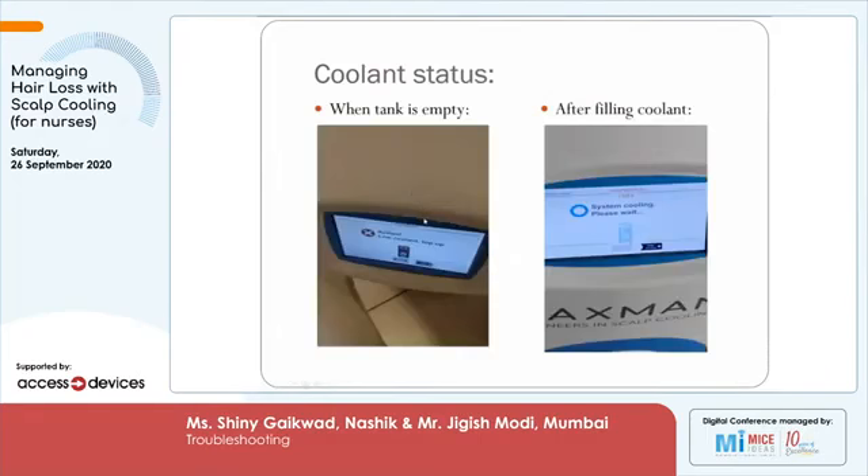Whenever the coolant is low, the machine will give you an alarm on the left side saying 'low coolant.' But it will allow the cooling to happen, so you can complete your chemotherapy cycles and then call the engineer. If nurses are trying to top it up during chemotherapy, you should top up the coolant. Sometimes when the coolant is empty and you start the machine for the first time, allow the system to cool until the coolant temperature shown on the top of the screen cools down to minus 4 degrees centigrade.